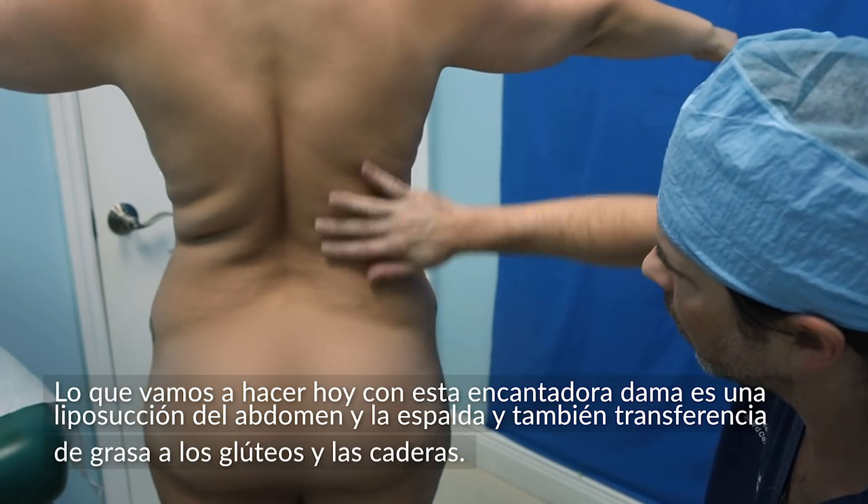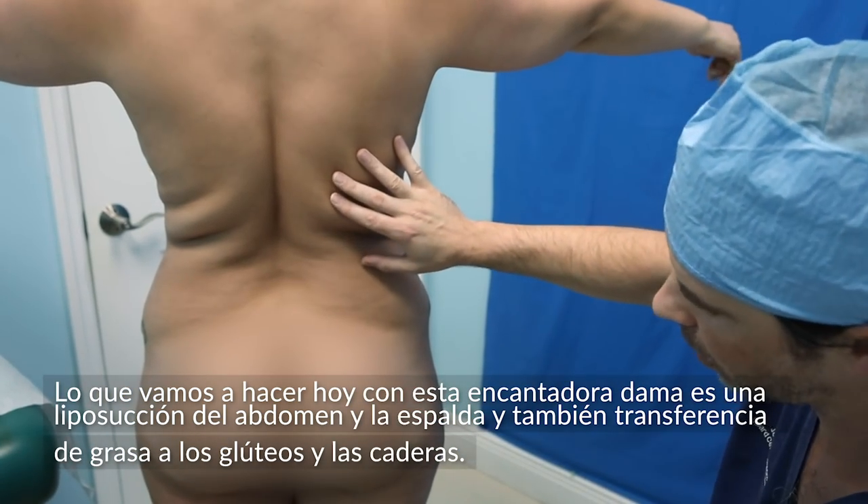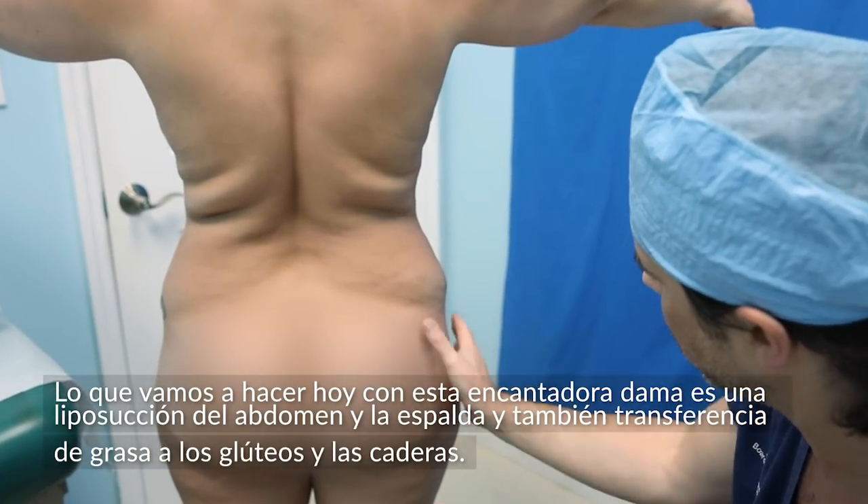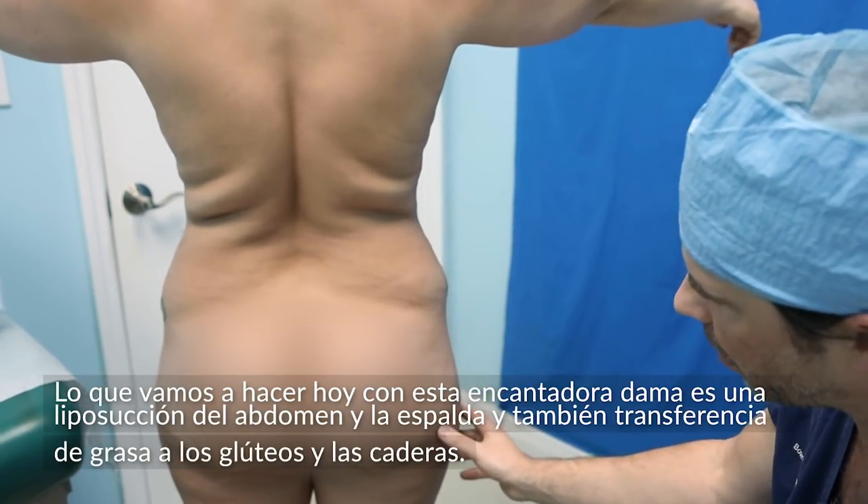What we're going to do today is a liposuction of the abdomen and the back, and we're going to do some fat transfer into the buttocks, and we're also going to do some transfer into the hip.